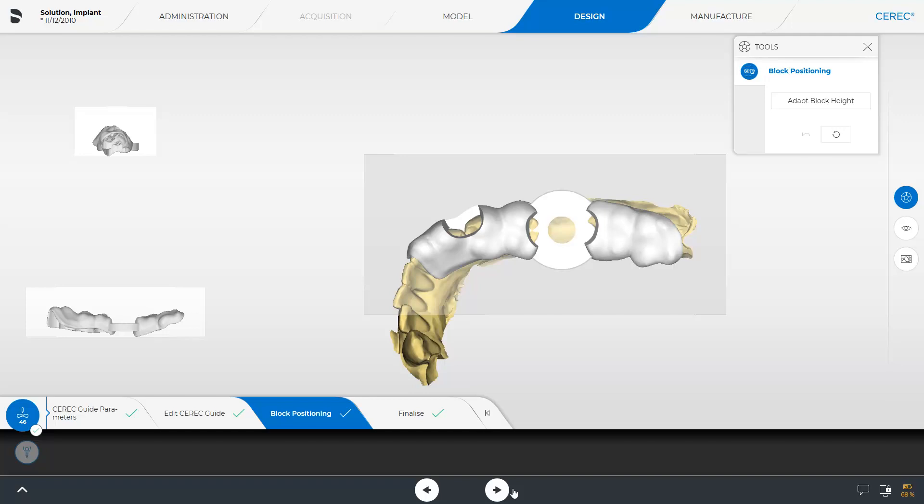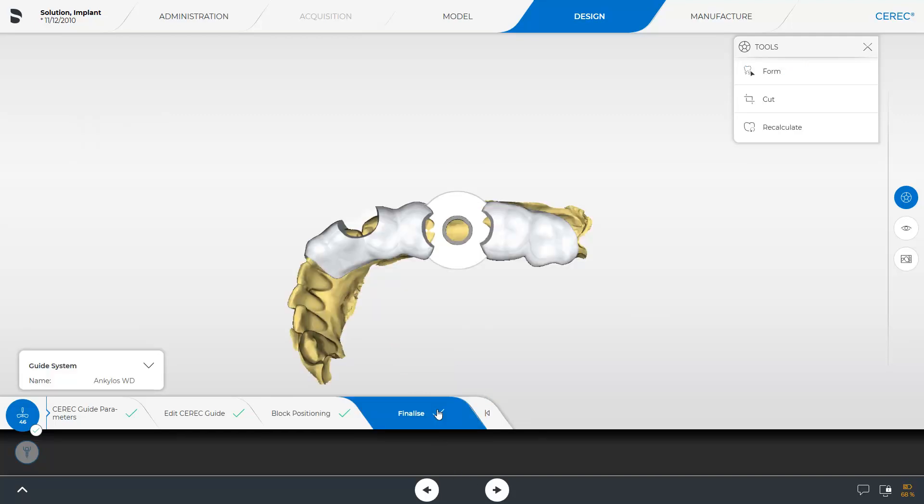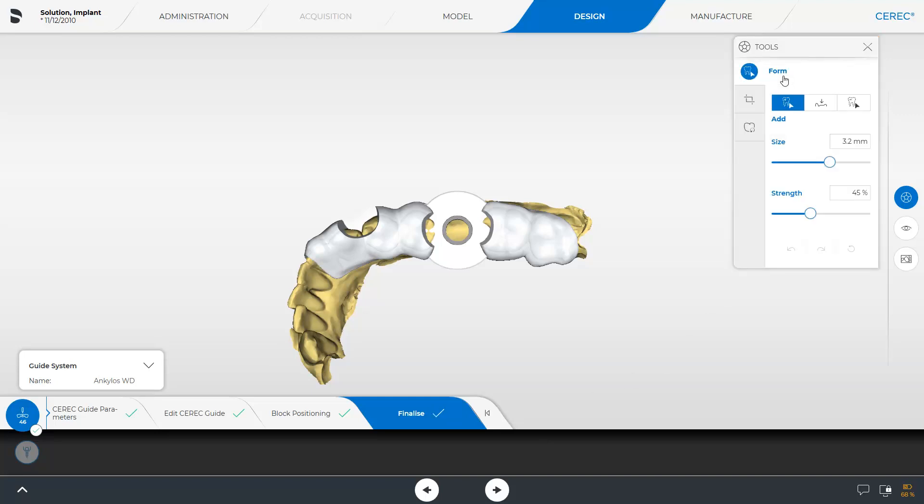However, we will proceed with the last step, Finalize. Again, there are three tools available here. With the Active Form tool, you have the option of adding, smoothing, or removing material in certain areas of the surgical guide. The size and strength of the tool can be adjusted using the slider.